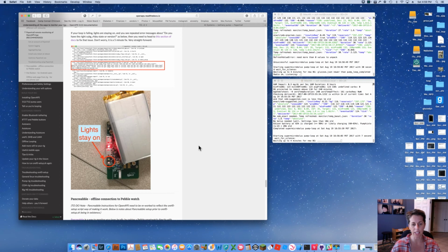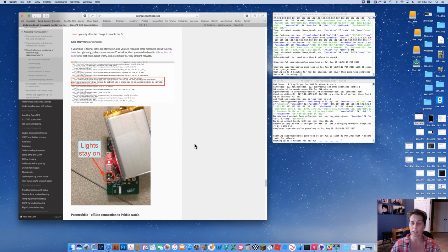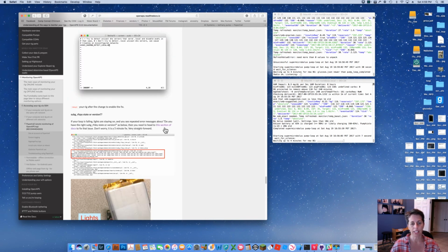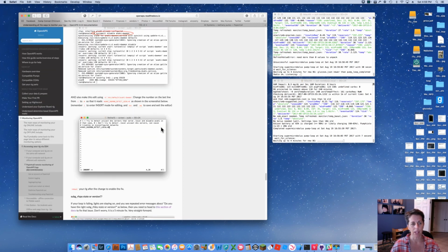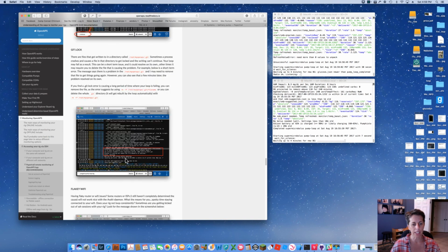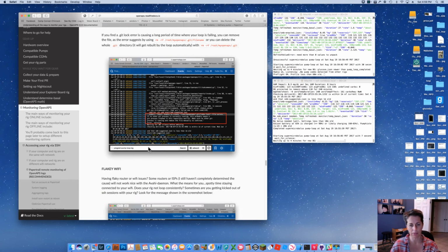Typically, the reasons I've seen it is either the Explorer board is going bad or the Explorer board needs to be reflashed. So you can reflash it. It's really simple. It's about 5 lines of cut and paste. But the easiest way to notice it is you'll have 2 little lights that stay on. So anyway, the link for fixing that is right here. You can go to that link and I'll tell you how to do it. Another common issue that you might see, I'm going to go back up here, is git lock. So I'm going to blow this up just a little bit.